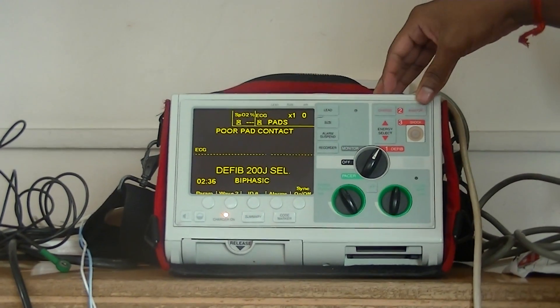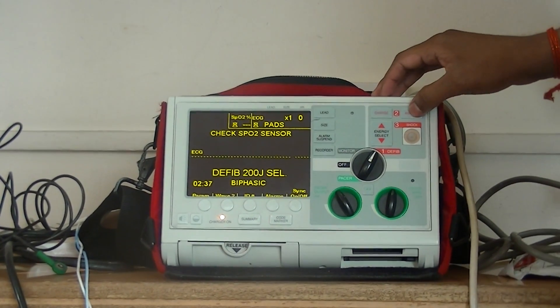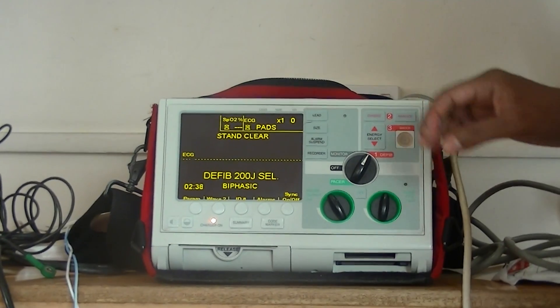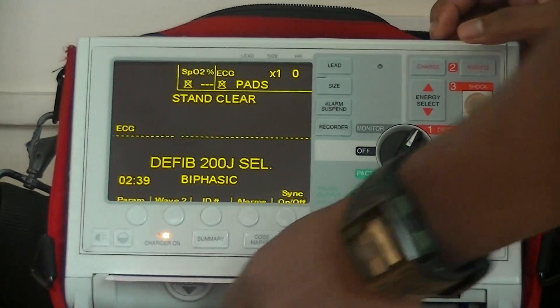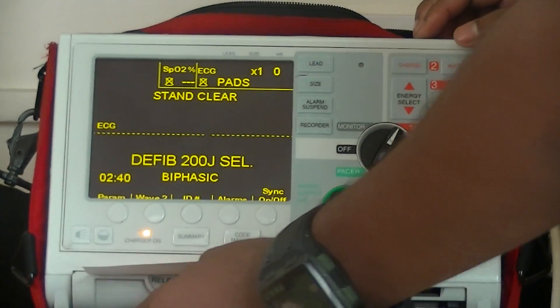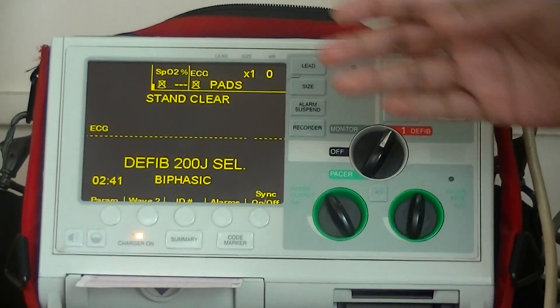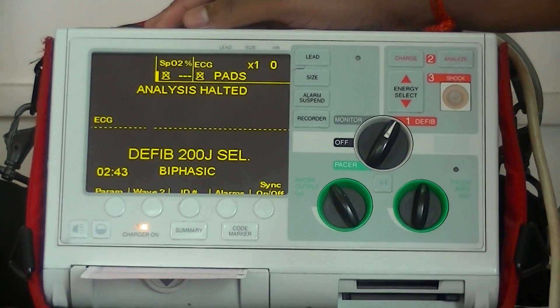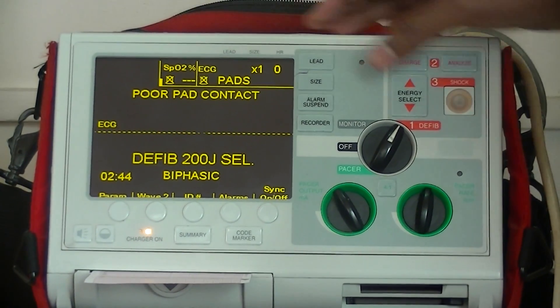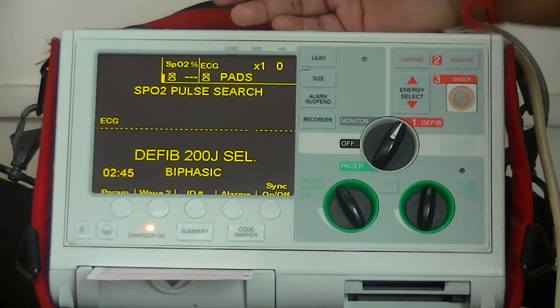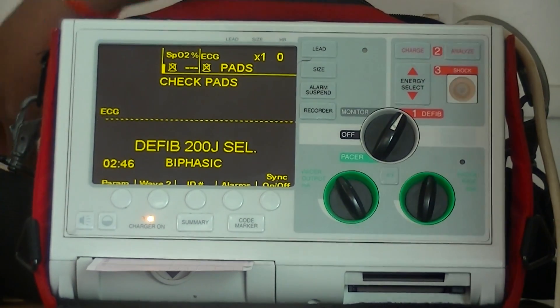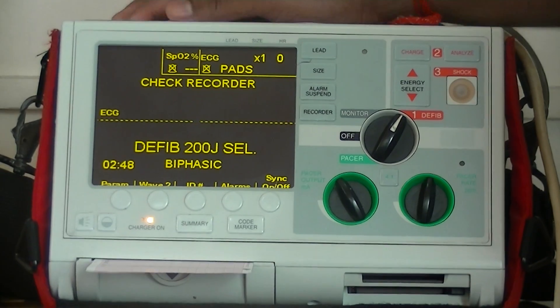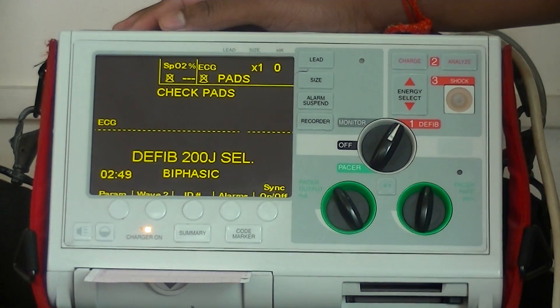If you want to use it as an AED, press the analyze button and it is going to analyze. Because it says stand clear. I am canceling this now because I did not attach this to the patient — the pads are connected but not attached to a patient.